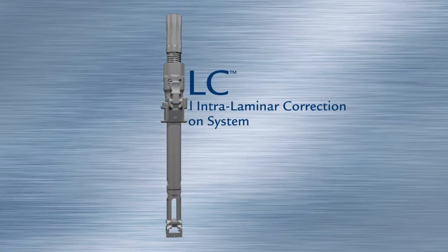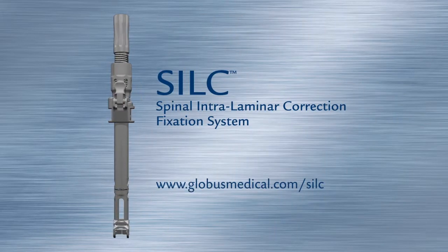SILC Spinal Intralaminar Correction Fixation System.